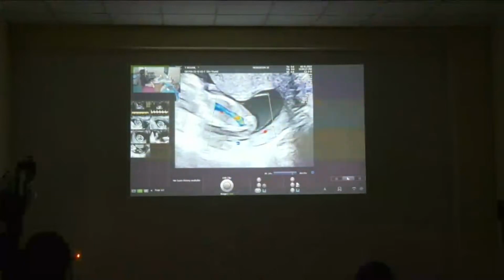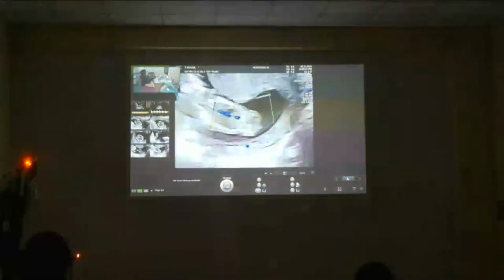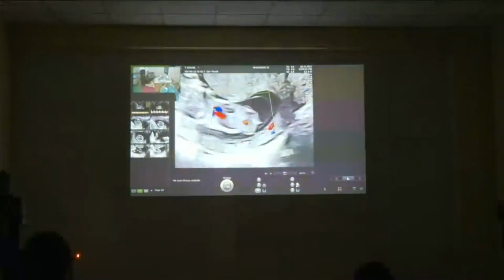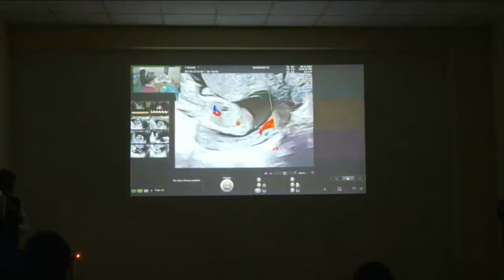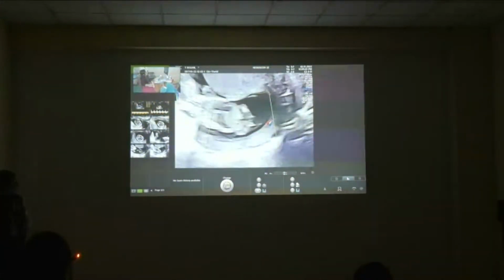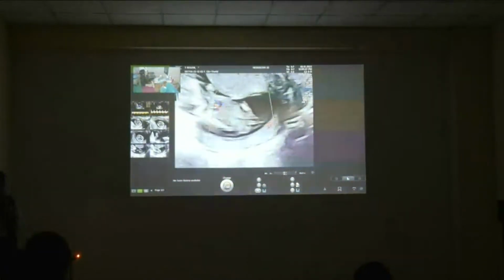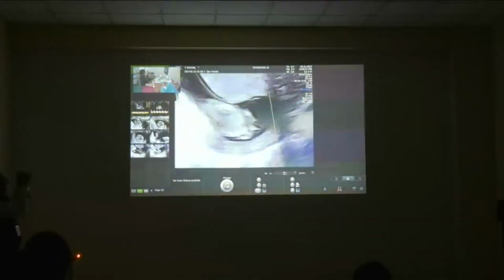Sometimes one umbilical artery might be a bit smaller than the other. But if we cannot see it in a transabdominal scan, we should always confirm it with a transvaginal scan. Okay, we'll take a look at this later.